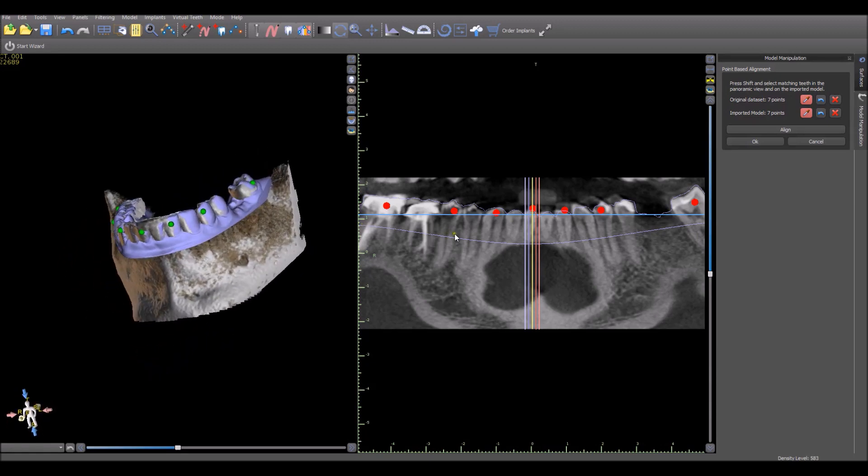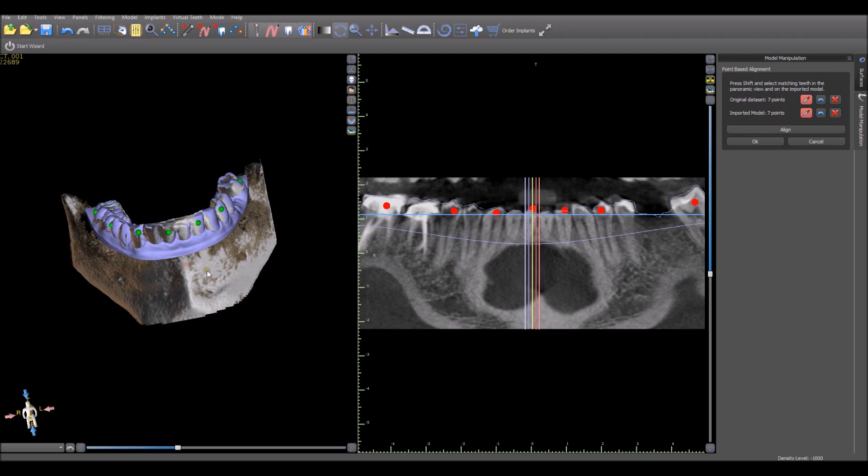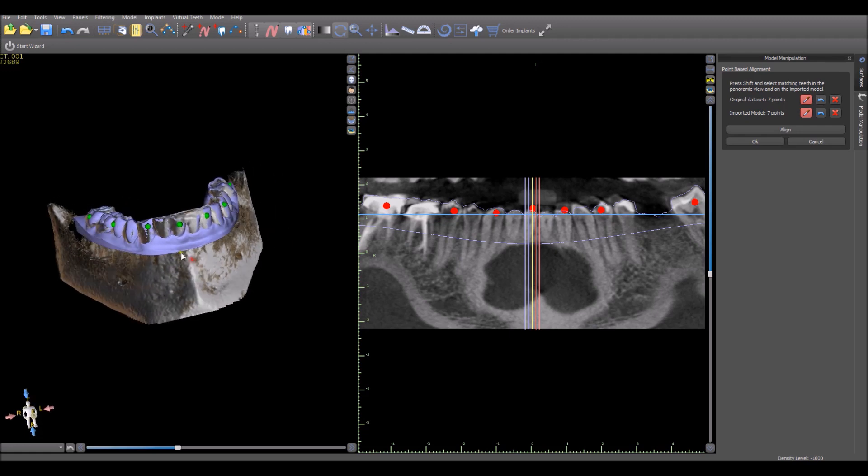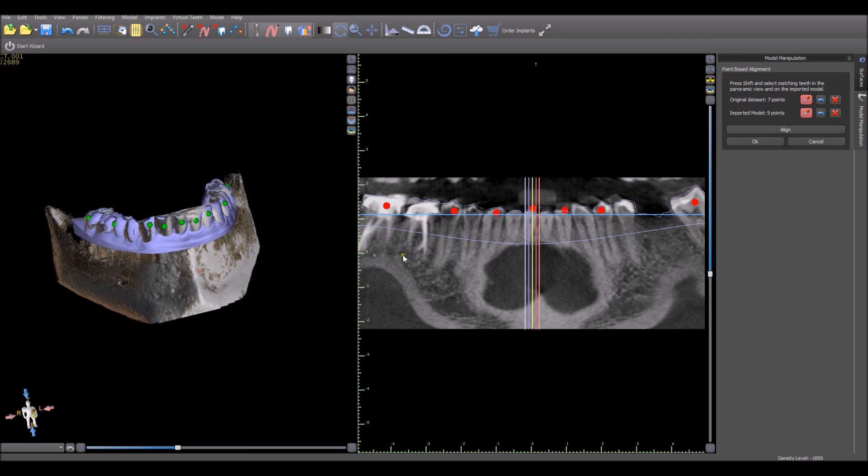We can see the outline of the model in the panoramic view on the right-hand side of the screen. If we want to fine-tune the placement, we could add a few dots on the scans and that would improve the alignment if we weren't happy with it. We could then just press the Align button and the alignment will be modified.